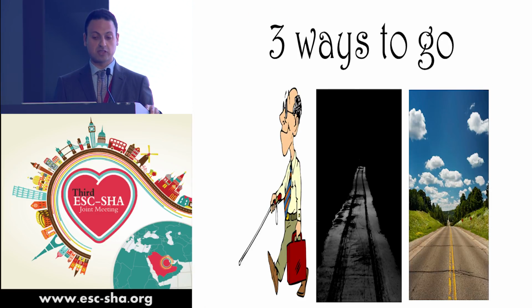And when you have a question in the cath lab, you have 3 ways to go, either to go blindly, angiographically, use ultrasound to guess, or use a light to see with the OCT.